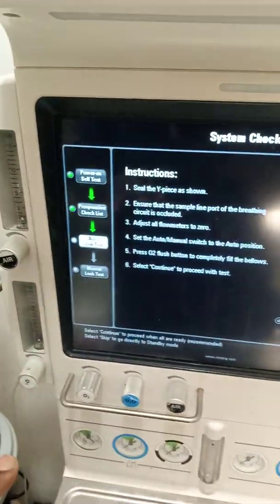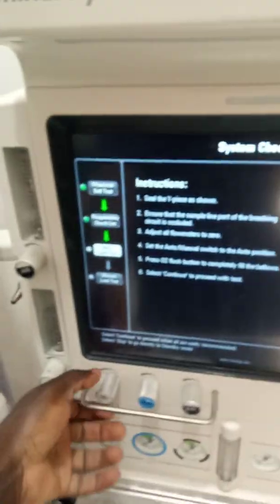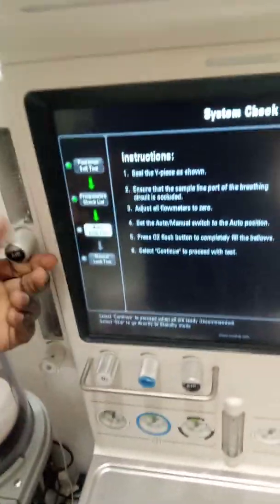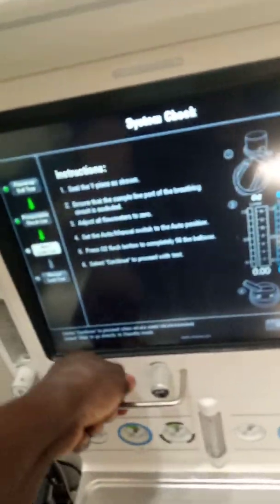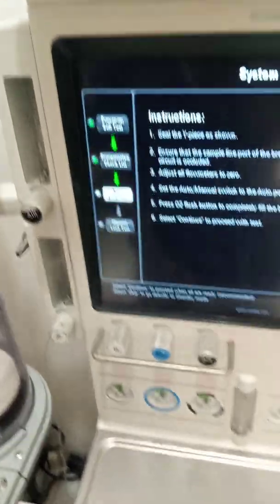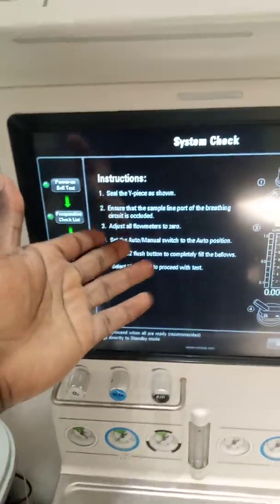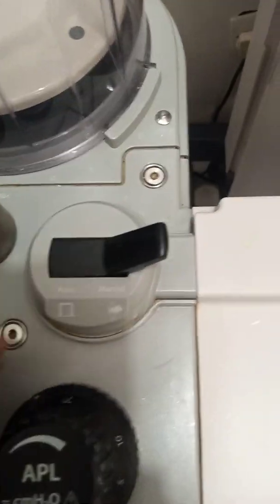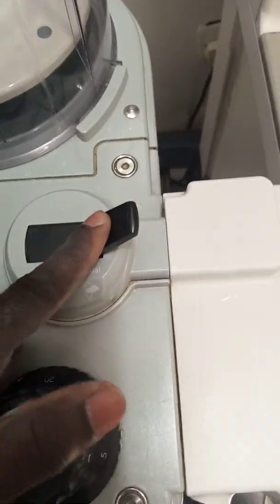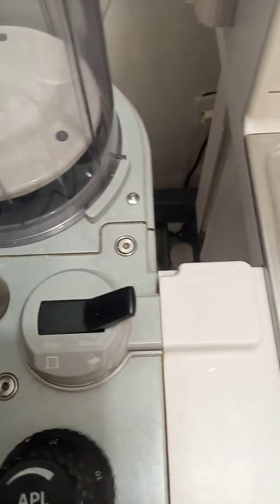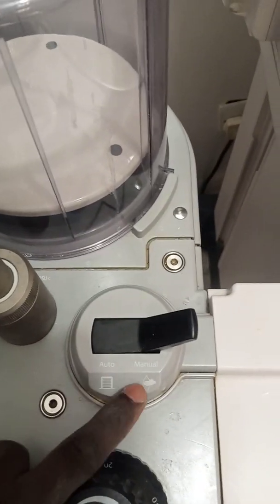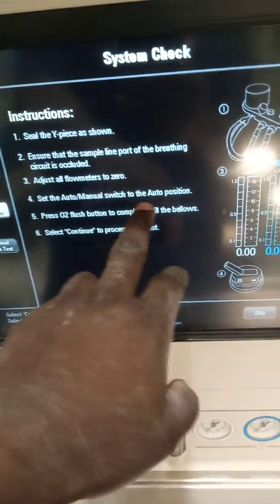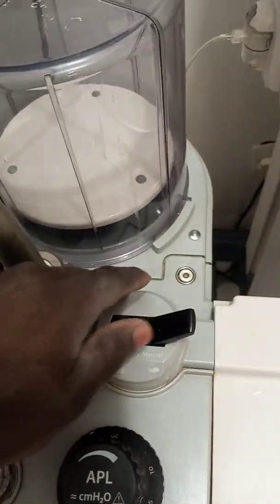Thirdly, we are to adjust all flow meters to zero — these are the flow meters and all have been adjusted to zero. Set the auto or manual switch to the auto position — as I stated earlier, this is the switch which can be moved to the auto or to the manual position, and the instruction is telling us to switch it to the auto position.